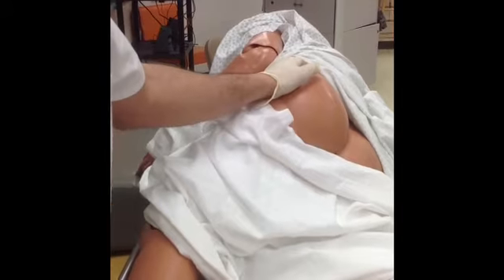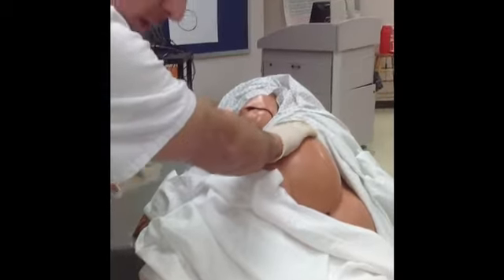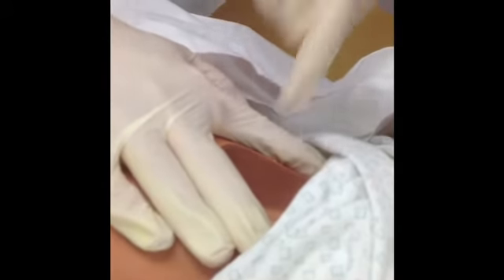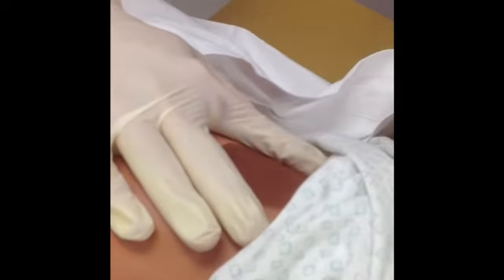So I'm going to take the top of my fingers and locate the iliac crest. And the heel of my hand is going to be over the greater trochanter. Okay, and I'm a lefty, so this is my dominant hand. It's going to be over the greater trochanter of the hip. My thumb's going to be towards his symphysis pubis, and my index finger is going to be towards the anterior superior iliac spine. And then the injection site is going to be between these two fingers, right in the middle. Right there, okay?